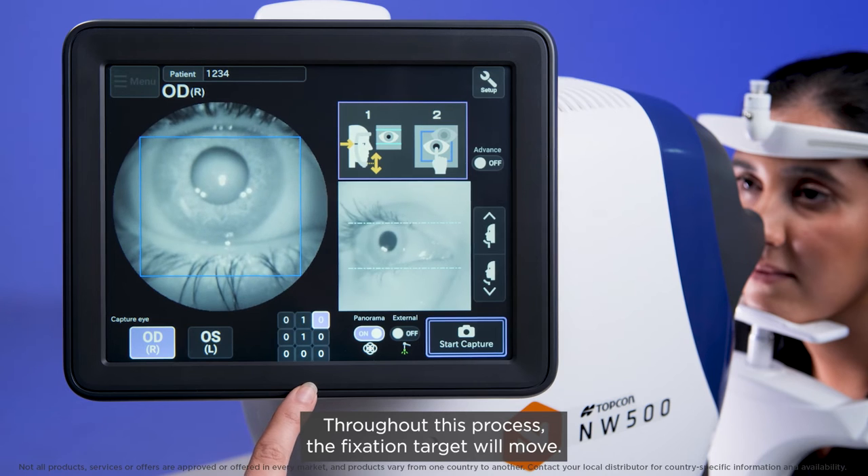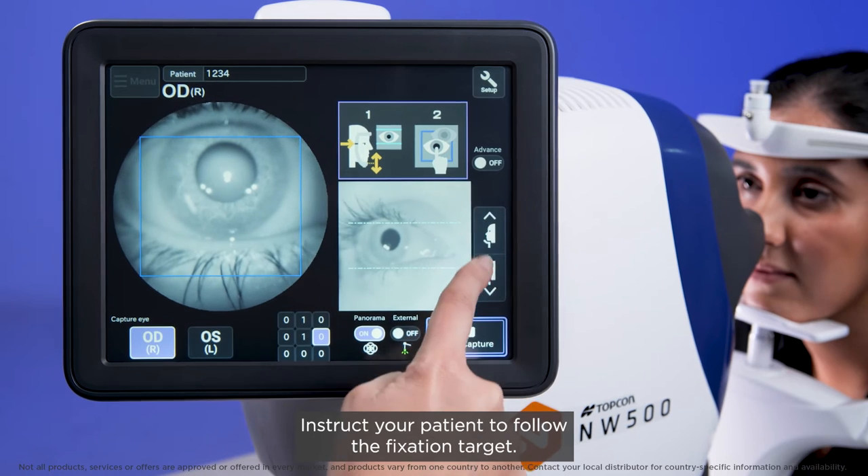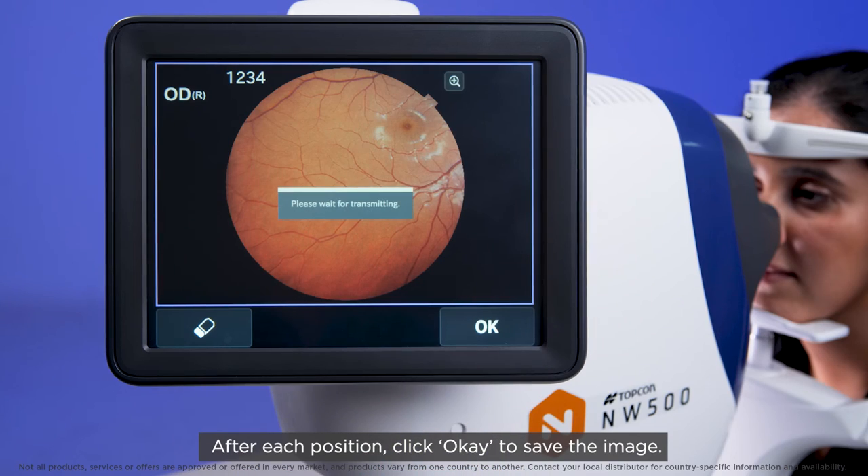Throughout this process, the fixation target will move. Instruct your patient to follow the fixation target. After each position, click OK to save the image.